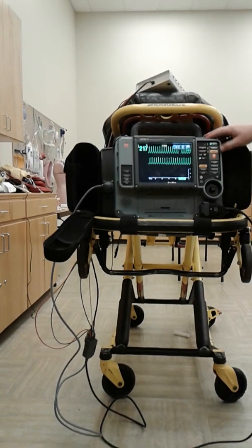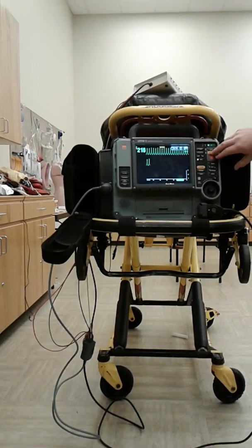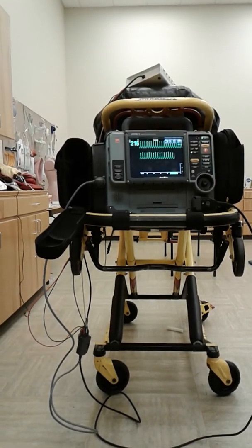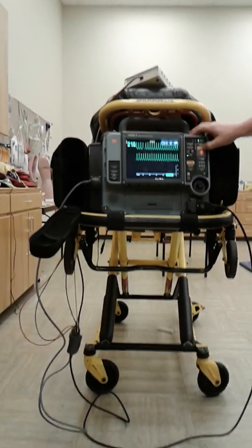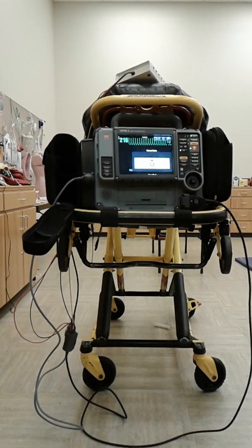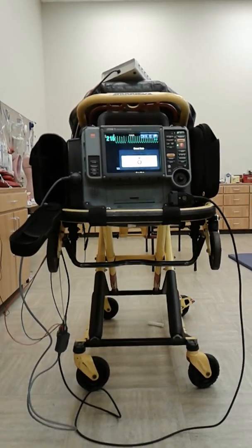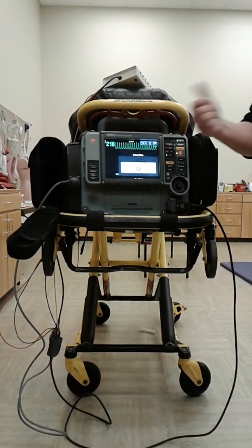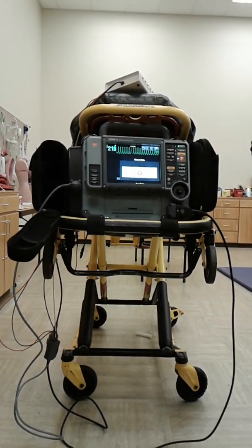Okay? So, whenever you would like to give your medications and stuff, that'd be a good time to use the event button. Yeah, you can hit the event button. Yeah, make them marking. Charge them up. 70 joules. And you are fixing to hit this patient with 70 joules of electricity. That is slightly greater than that little bit of milliamps you just hit them with on pace.